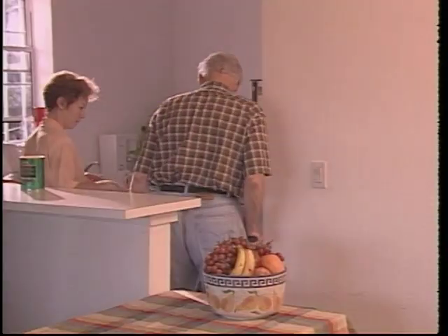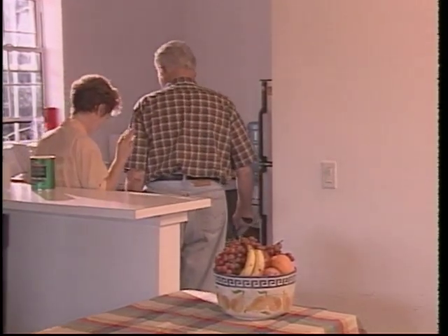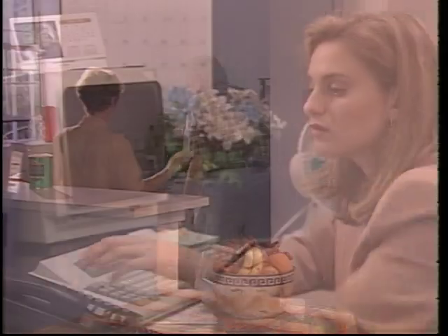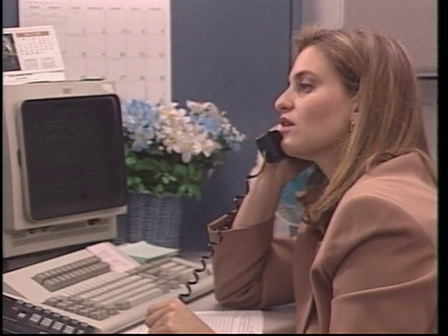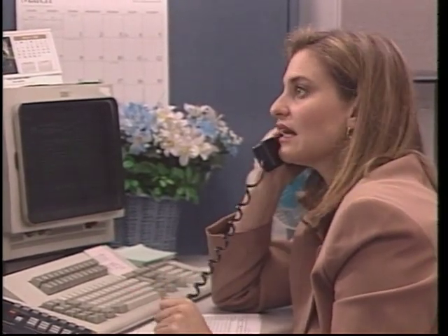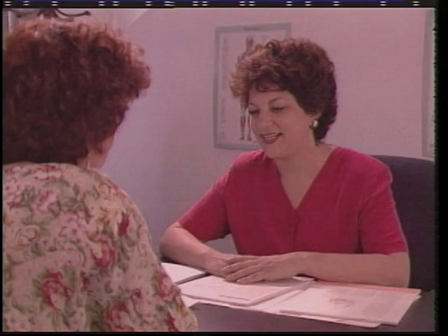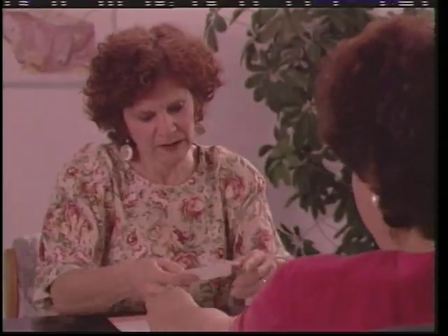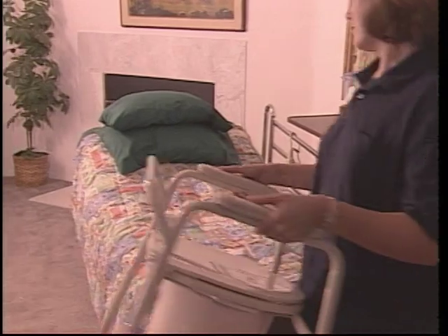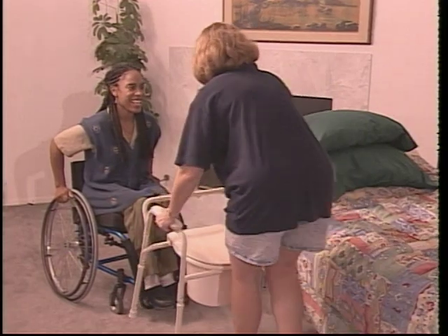When any one of us initiates home care, we are each required to assess the home environment. And the process doesn't end there. We reevaluate with every visit. Home assessment may also involve insurance case managers who authorize the acquisition of mobility devices. Concerned with preventing injury and costly errors, they evaluate the patient's psychosocial and medical condition, as well as take into account the results of the home assessment. But the central figures of any home assessment are, of course, the patient and the caregiver themselves. It is their responsibility to understand, implement, and maintain the safe environment that the therapists, nurses, and technicians have recommended.